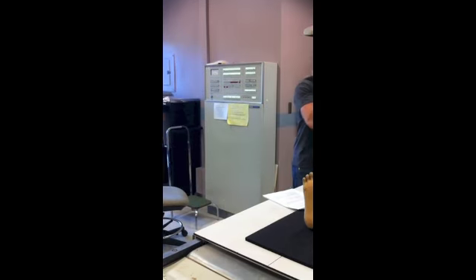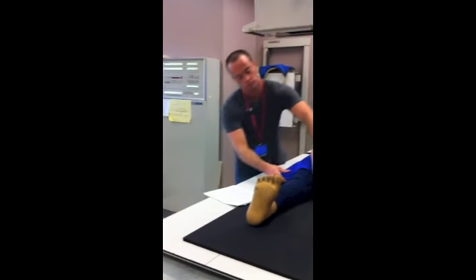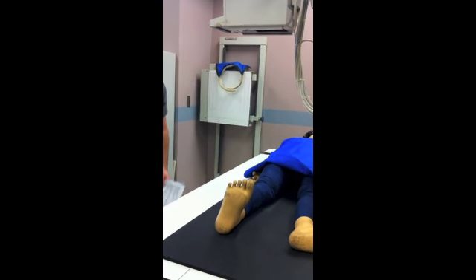For the knee, because we're only getting the knee, I like to shield the entire patient. Okay, now I take the image. Don't move.